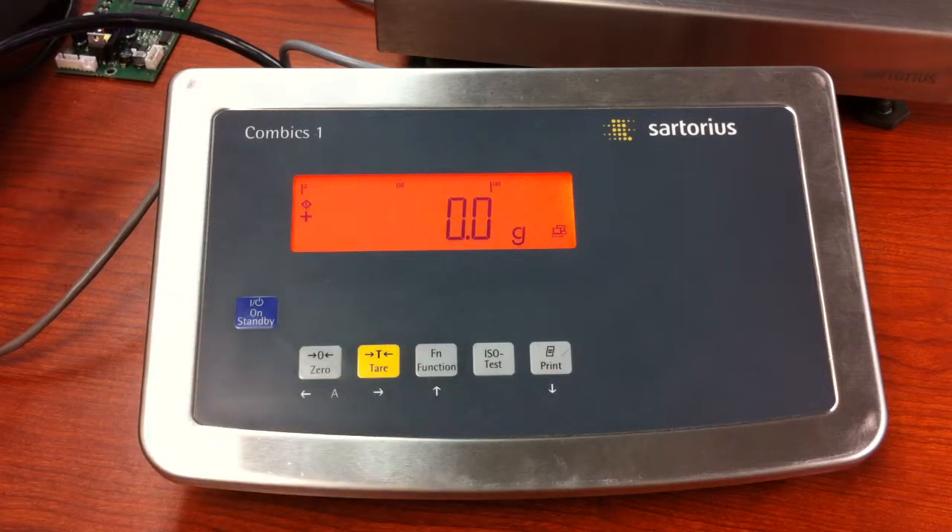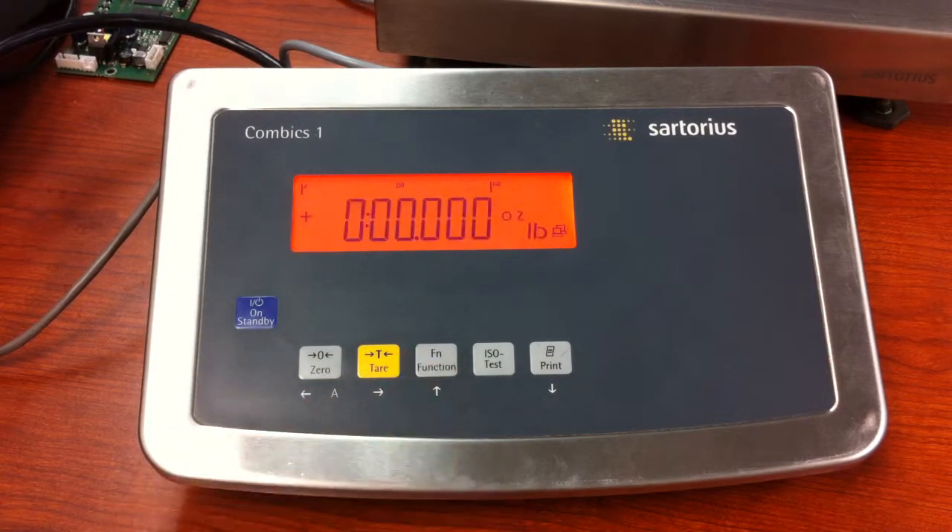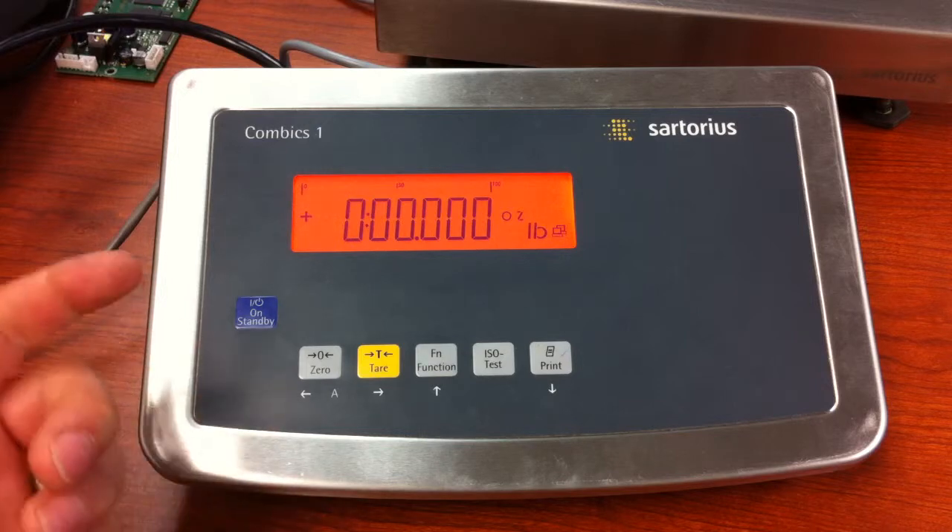Our initial unit of measure is grams. And if we press the function key, we now get pounds and ounces. So that's how you do it.